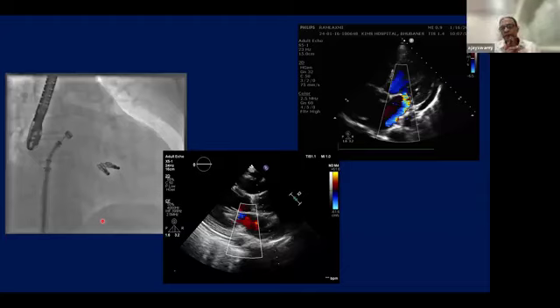But the whole idea of the mitra clip is to reach a hemodynamic state where the LA mean actually drops. You are supposed to monitor the LA pressure and the PA pressure. Sometimes you will put an additional catheter inside your sheath or take an additional puncture so that you do not create an elevation in LA mean.